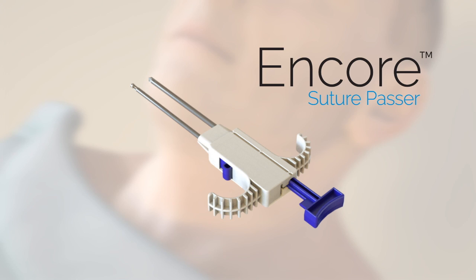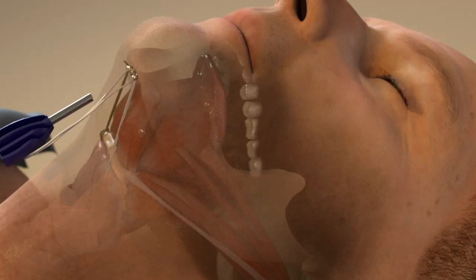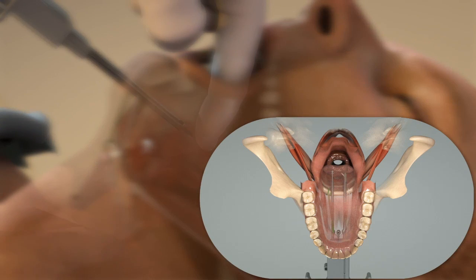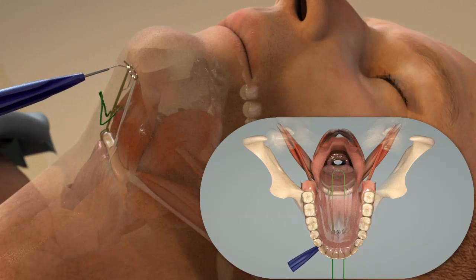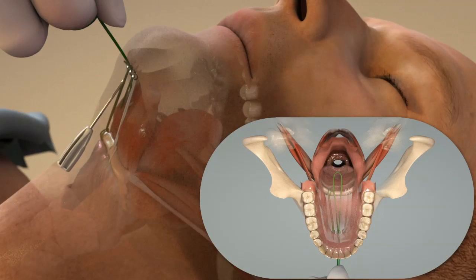In some cases, lifting and suspending the base of the tongue may be recommended by your doctor to further open the airway. Through the same incision, a third suture anchor is placed in the mandible, and a stitch is placed in the base of the tongue with the encore suture passer. The suture is then exchanged for a suspension suture and threaded into the third anchor. The suture is tensioned, lifting and supporting the tongue, and locked into the anchor.